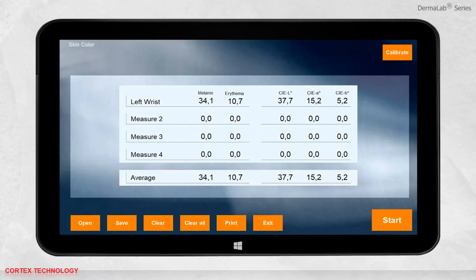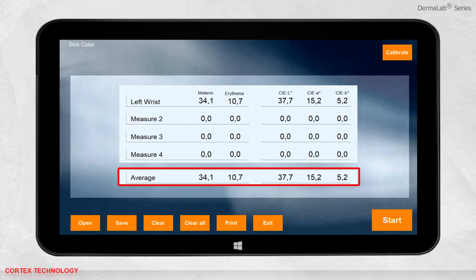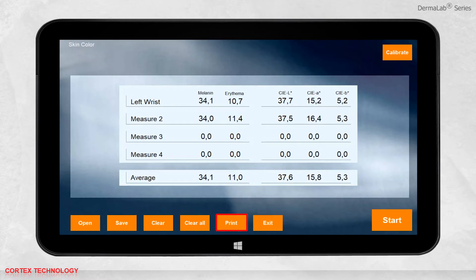When you take multiple measurements, you can see the average of each value will be calculated. As always, you can save, print, or open previously saved data.